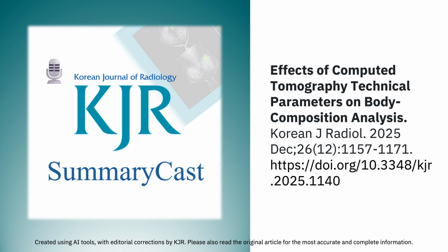It is. The idea of using routine CT scans, ones done for completely different reasons, to opportunistically measure muscle and fat is incredibly powerful. It's a huge source of data for research on things like sarcopenia and obesity. But that's the exact problem, isn't it? Routine scans aren't standardized for BCA. They're optimized for finding a tumor or a bleed. So if you're pulling data from all these different scans, how do you know the numbers are reliable?